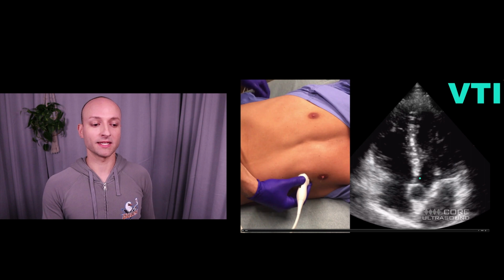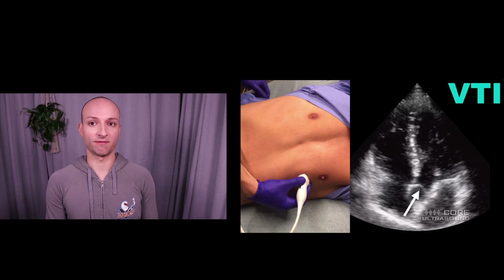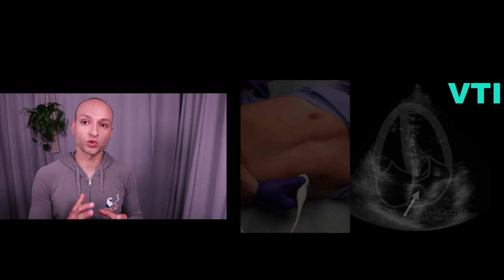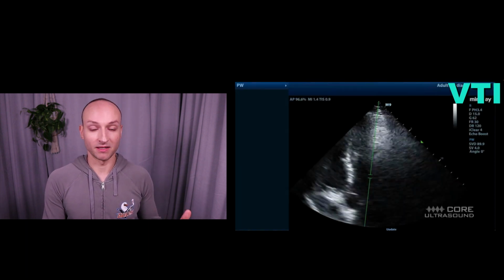That's this right here. Here is the aortic valve. And when you get this view of the aortic valve, what you're going to do is you're going to place your pulse wave Doppler gate right on the inside of that LVOT, just on the ventricular side of that aortic valve, and you're gonna get a measurement, and this is what it looks like.